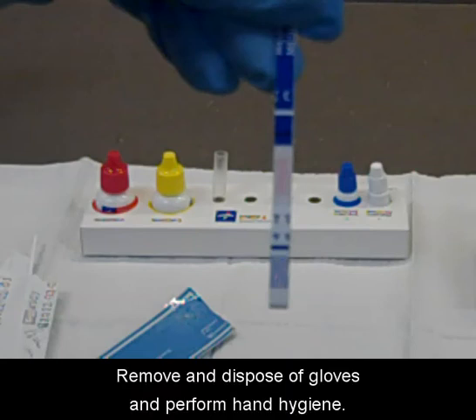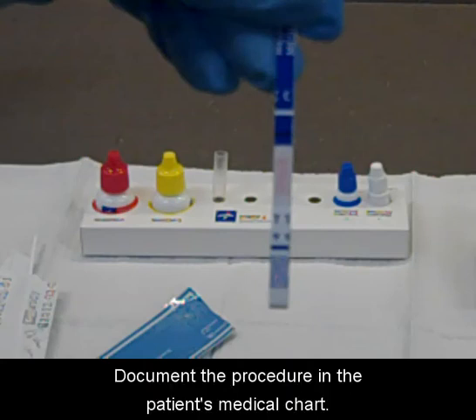Remove and dispose of gloves and perform hand hygiene. Document the procedure in the patient's medical chart.